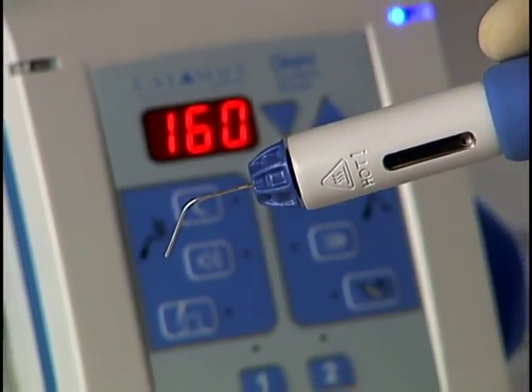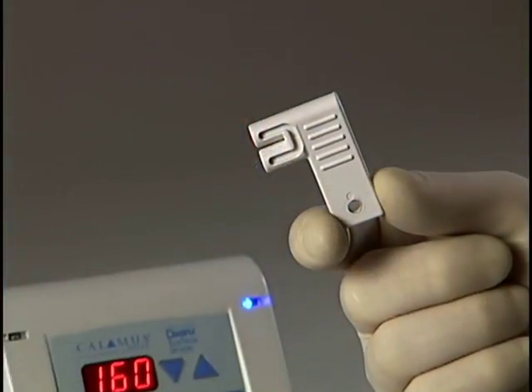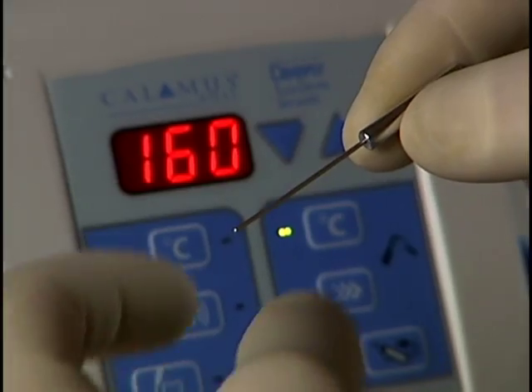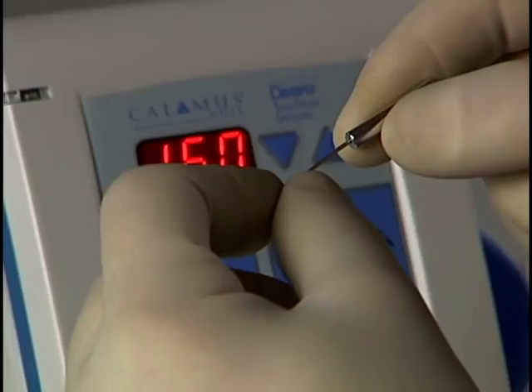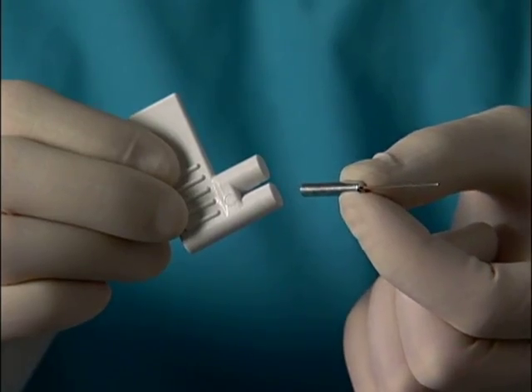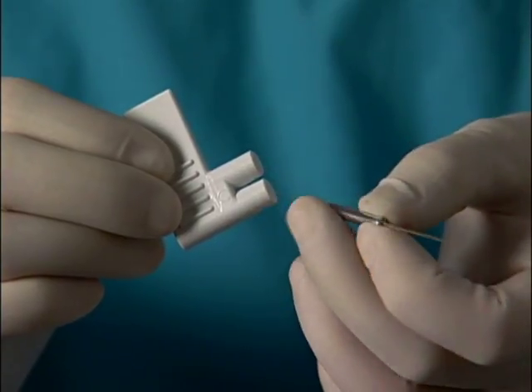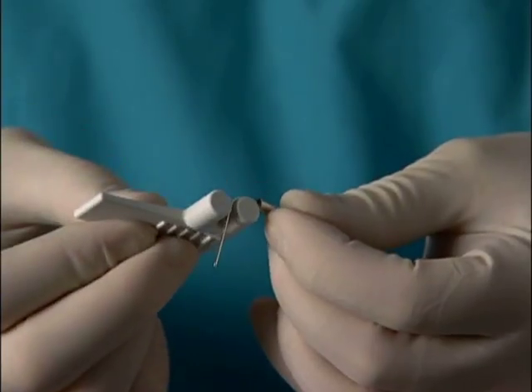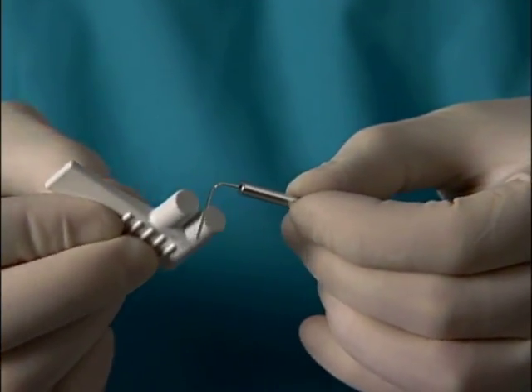Bending the needles of the calamus cartridge is easily accomplished using the calamus bending tool, which is included with every unit. Because of the heat transferred to the tip, finger bending is not recommended. Determine the length needed to adequately obturate the canal space. Generally, allow enough length in front of any bend to get within five millimeters of the working length.